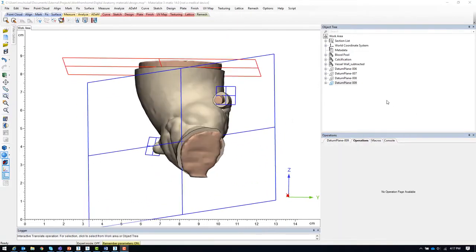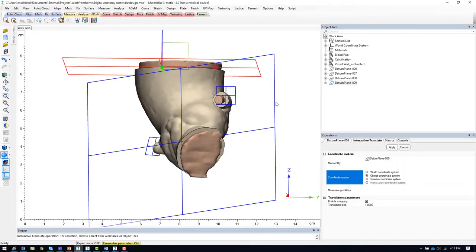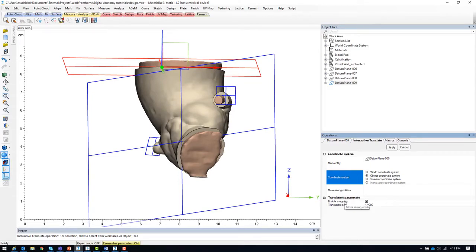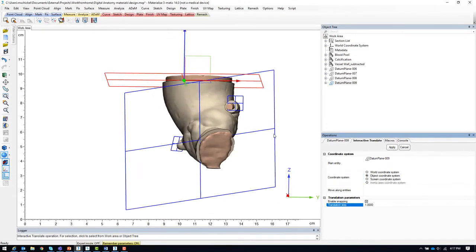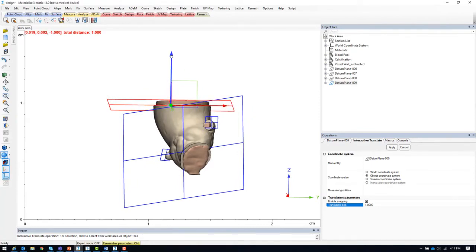Next, we will move each datum plane so that it is one millimeter inside the vessel wall opening. To do so, we will use the interactive translate tool. We will select one datum plane at a time. The coordinate system will be set to object coordinate system. And we will turn on the enable snapping and translation step to one millimeter. Now we can grab the arrowhead to translate each datum plane one millimeter towards the inside of the vessel wall opening.